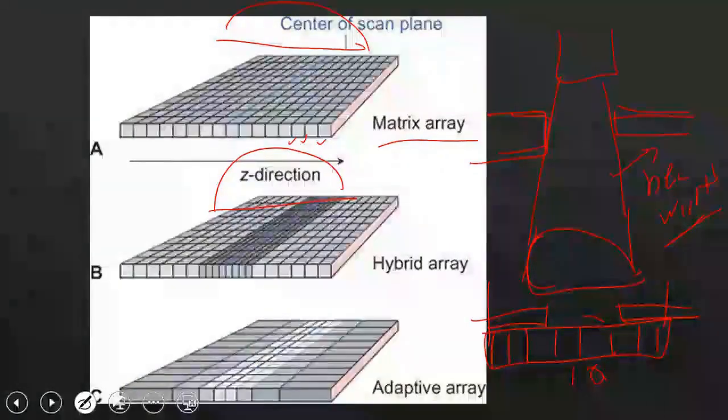But in reality, you are exposing the entire body, but you are collecting data to reach the resolution you need. But it's at 8 millimeters of pitch. Is that understood?